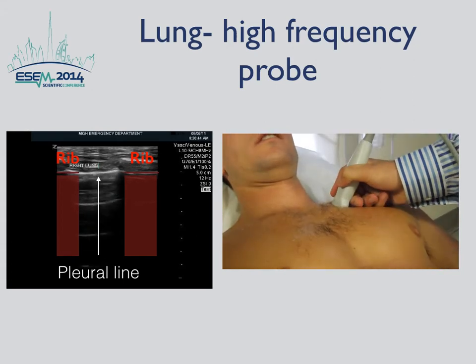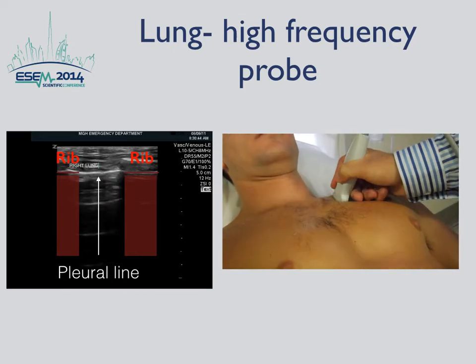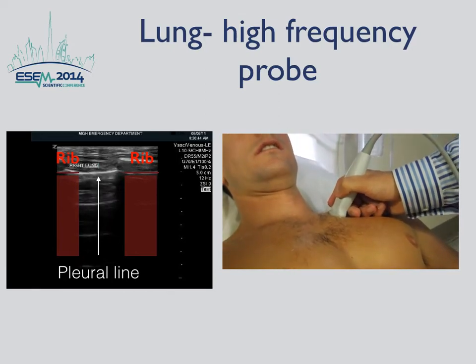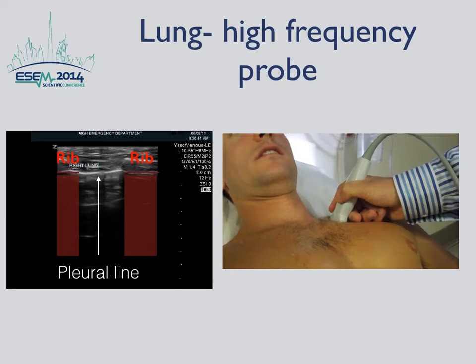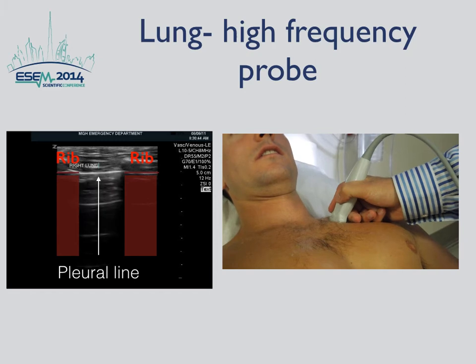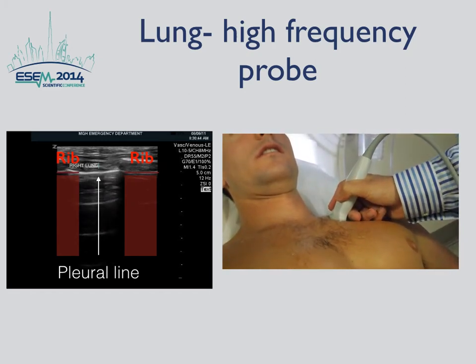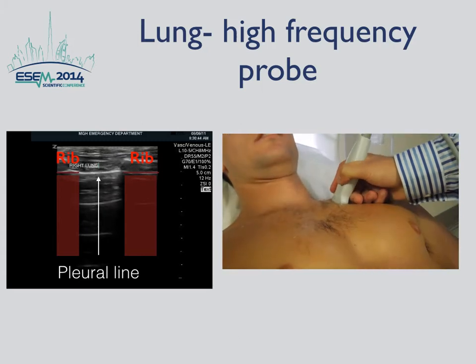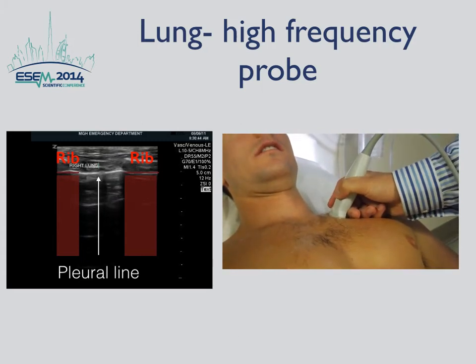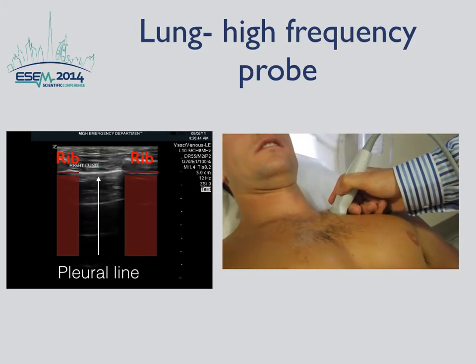If a patient is supine, the most important place to look for a pneumothorax is the anterior chest wall. If a patient has a penetrating trauma or has just had a procedure, the most important place to look for lung sliding is directly below the point of penetration. Obviously, looking in more places increases the sensitivity and specificity of your exam.